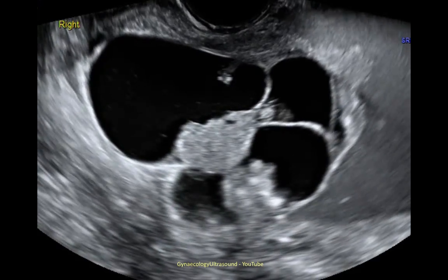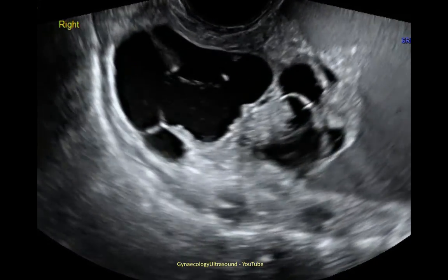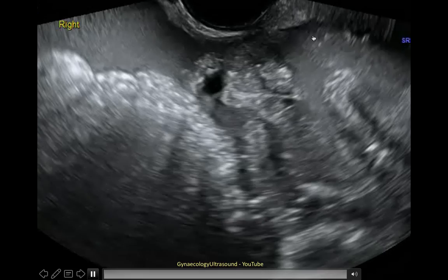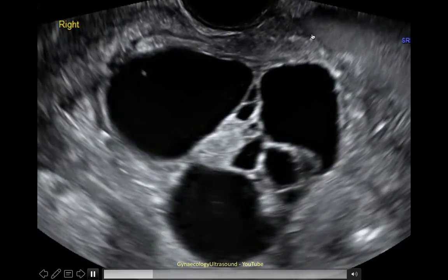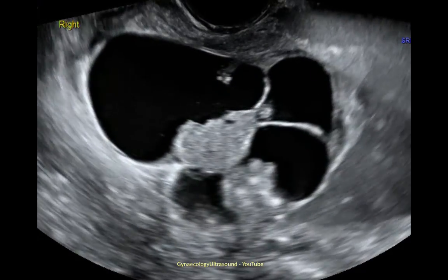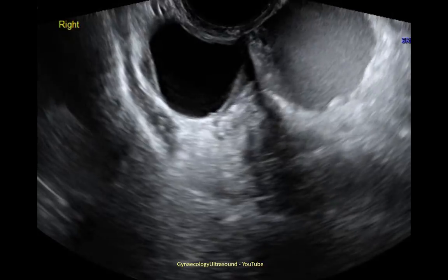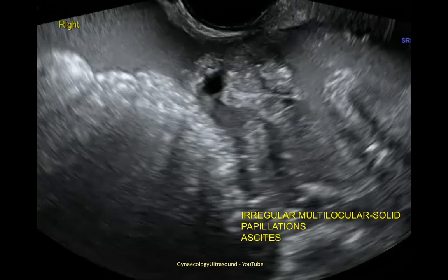This is a video of an irregular multilocular solid lesion with papillations and ascites. You can see the swirling free fluid all around this mass. It's irregular multilocular solid with papillations and ascites.